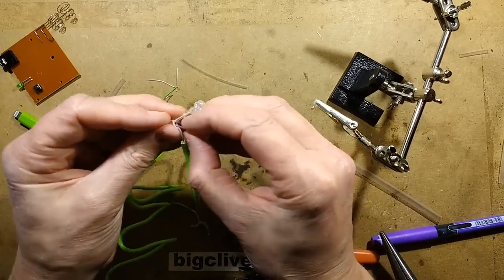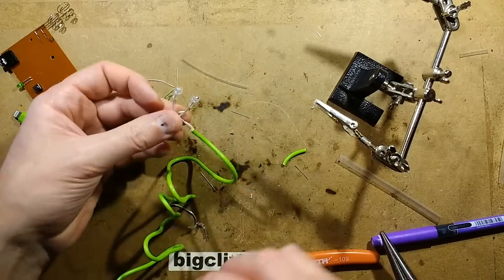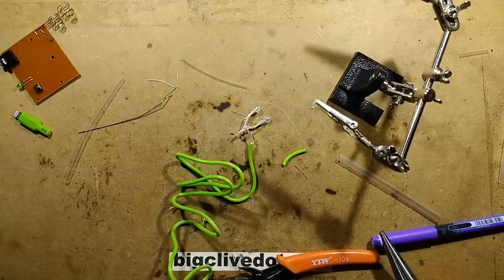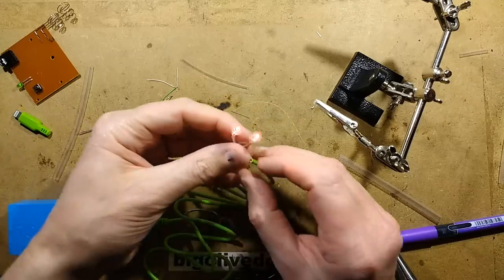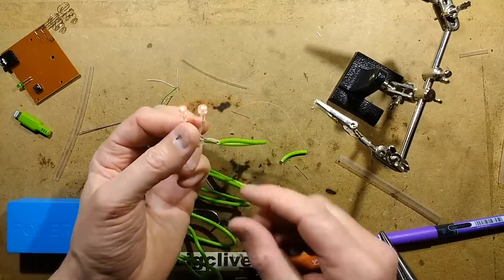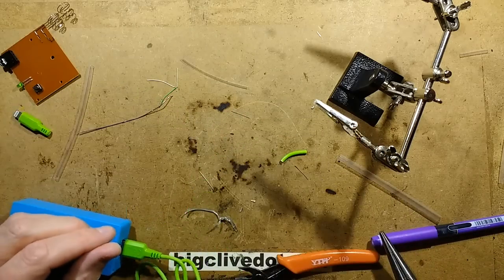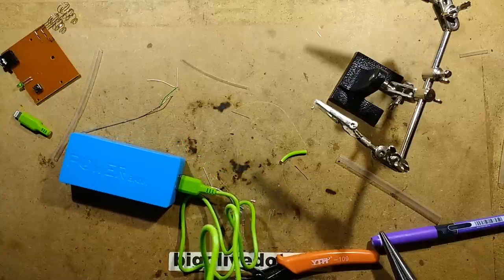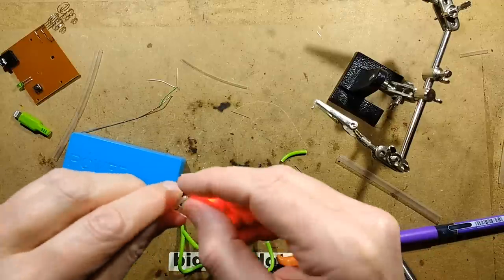Here we go — plug it in. We'll just bend it ready for nostril insertion. There's our nostril probe. Find a USB power supply — let's use this one. High-power nasal probes! Will I stick them up my nose? Yes — I'm just sticking it up my nose now. It feels like LEDs stuck up my nose. I'll pull it out now and make sure it's clear of mucus so I don't alienate you all.